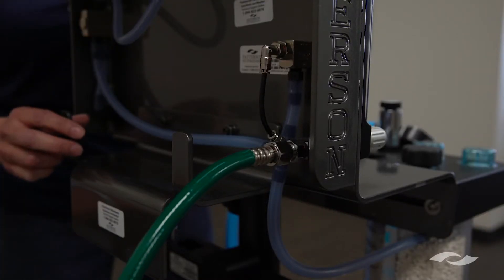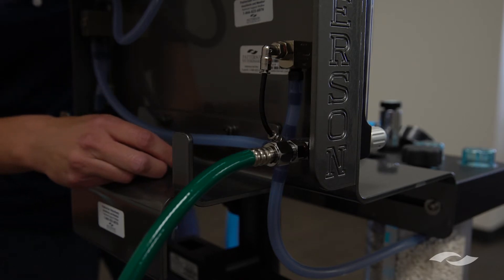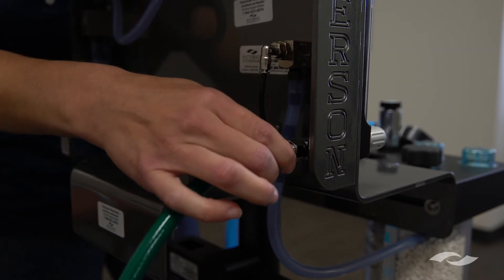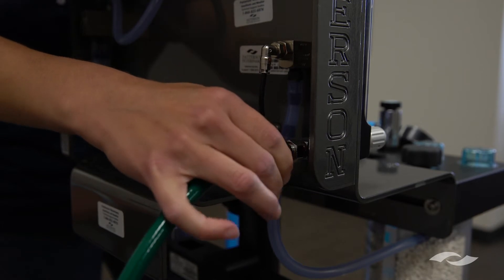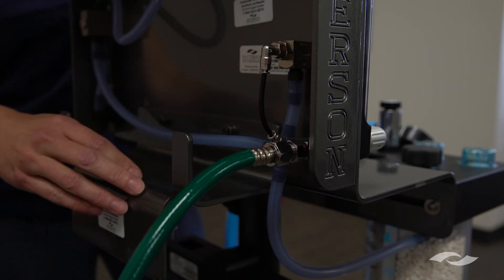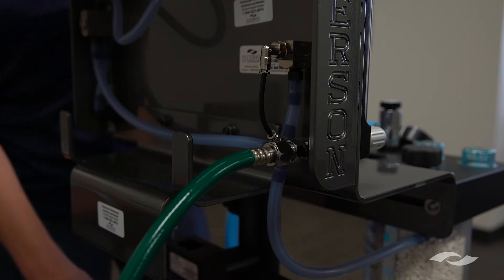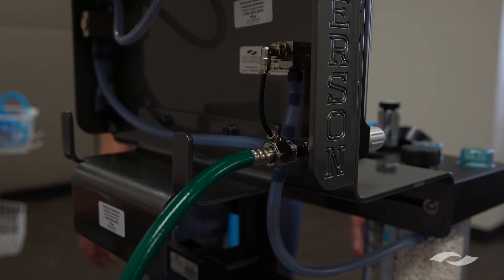The first step is to make sure that you are connected to an oxygen source that is regulated to 50 to 55 psi. In this instance we are attached to our central oxygen supply, which would be our wall outlet. Otherwise you may have portable E-tanks hanging here. Just make sure that it is regulated to 50 to 55 psi.